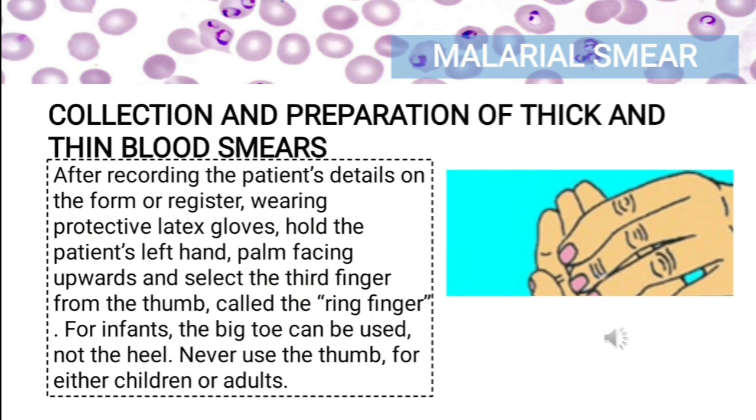First, you must wear your protective gloves when handling blood or taking blood samples. Avoid getting blood, including that from unstained slides, on your fingers or hands. And then cover any cuts or abrasions on your hands with adhesive dressings. And lastly, you must take care not to prick yourself or others with any sharp instrument that has been in contact with the blood.